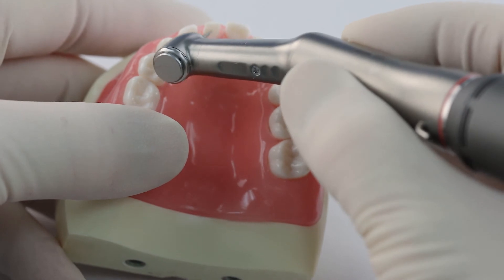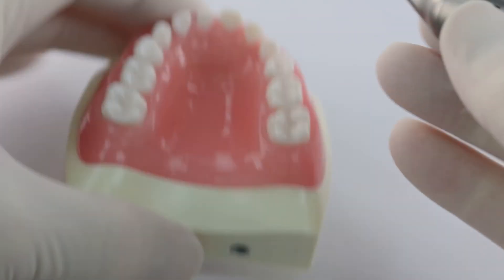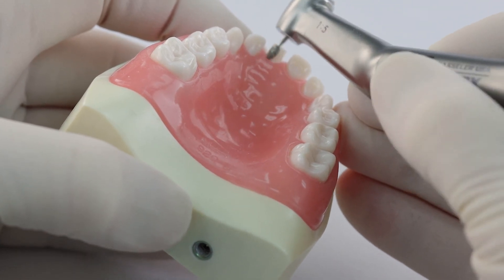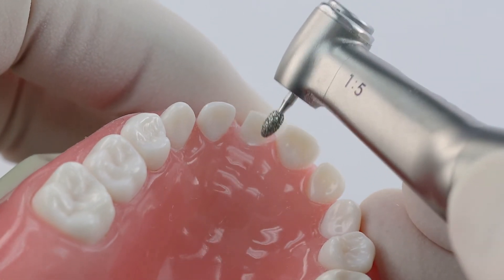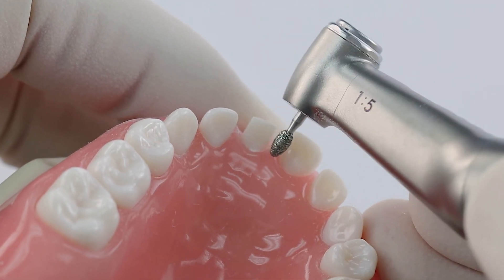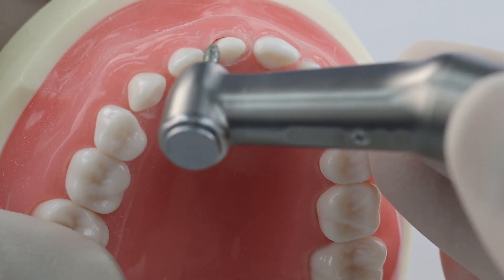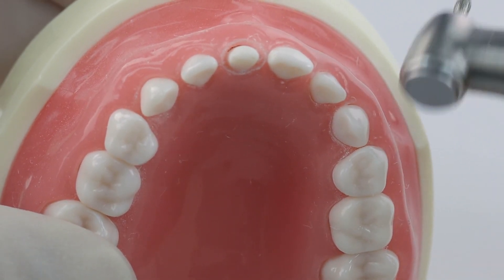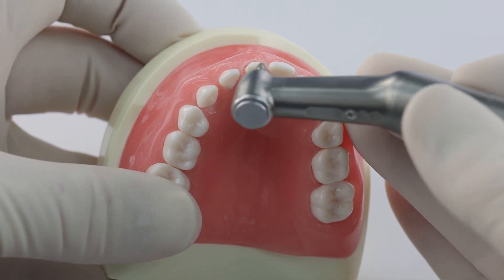On the lingual, a question that people always ask is how much lingual reduction do you need? There's not an exact amount — it's not like 0.5 or 0.7 millimeters. Basically what I do is make the lingual surface concave and kind of scoop it out. But the important thing to remember is we want to include the incisal edge. So make the lingual surface concave and then extend or pull that burr up to include the incisal edge, so that you get that thin incisal edge that follows the arch form. That's the key point for anterior tooth preparation, and it's created by your second plane of reduction on the buccal and carrying the lingual reduction up to include the incisal edge.